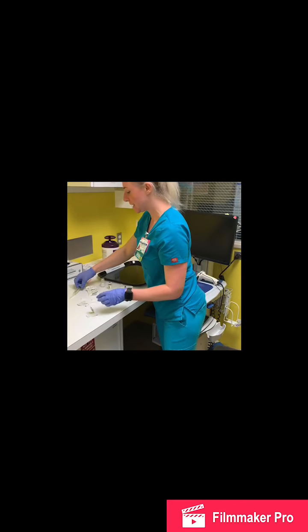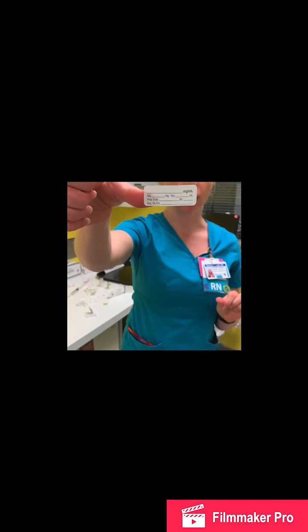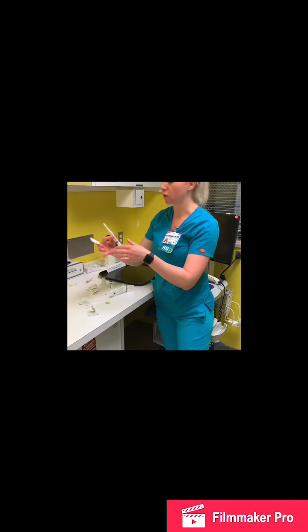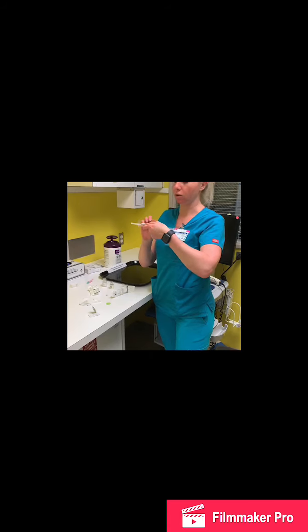I will then immediately label it here with my label. So the labels look like this, and you need to fill in all the information on there unless you are going to be carrying that medication into the patient's room without setting it down anywhere in the meantime. It's probably not likely, so I'm going to label it right now.